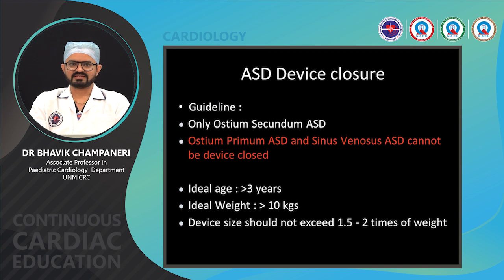This is important: the device size should not exceed 1.5 to 2 times the weight. Suppose the baby's weight is 10 kilo, I would be worried if I am putting in a device which is more than 20 mm.